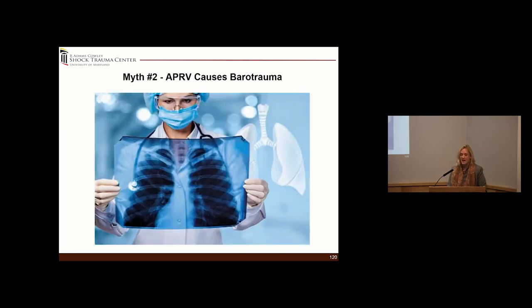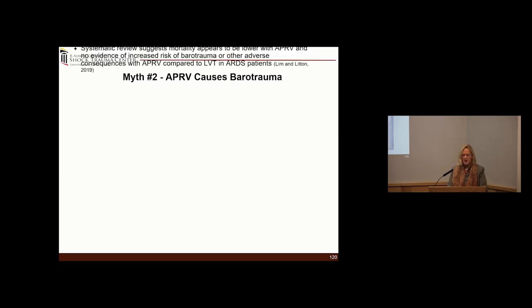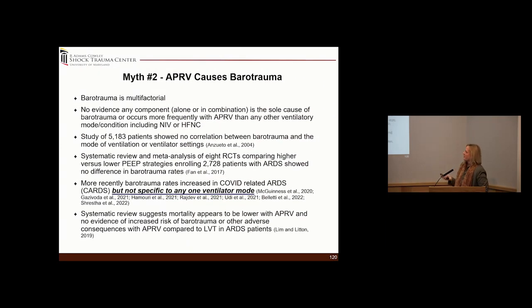We hear this a lot: APRV causes barotrauma, and it is not questioned. It is emphatic. It does cause barotrauma. But here's the problem with that. Barotrauma is multifactorial, and in fact, there's no evidence that any component alone or in combination is the sole cause of barotrauma. And this means that, compared to any other mode, invasive, non-invasive, they actually looked at a study of 5,183 patients, and there was no correlation between barotrauma and the mode or any setting.